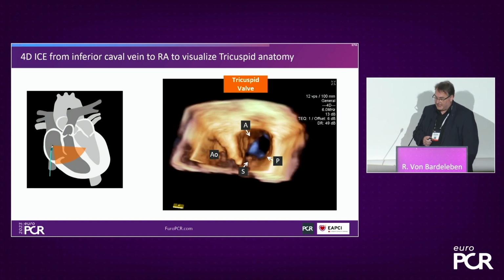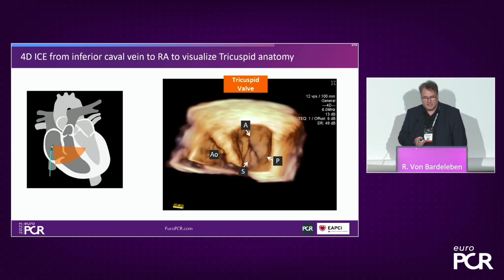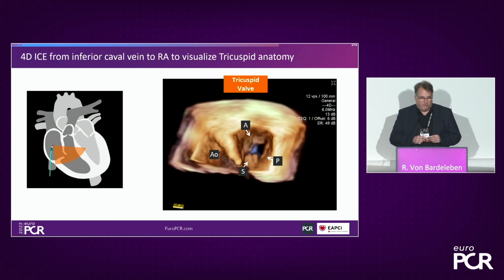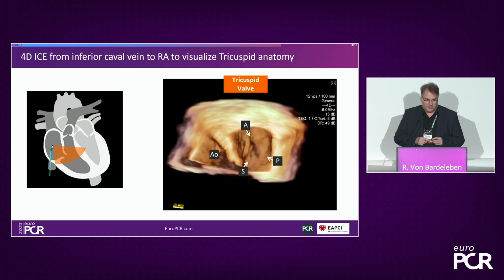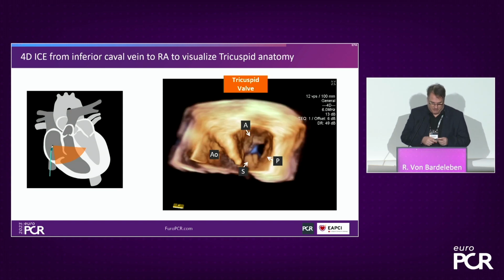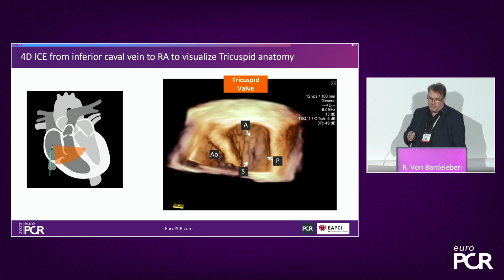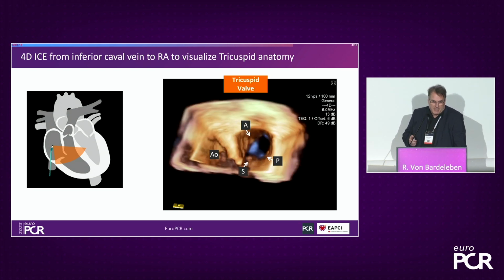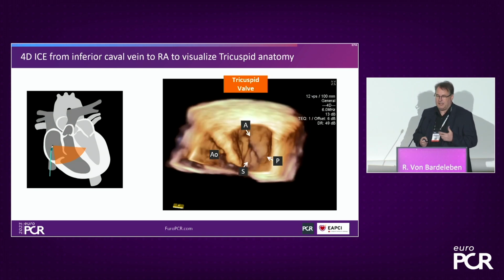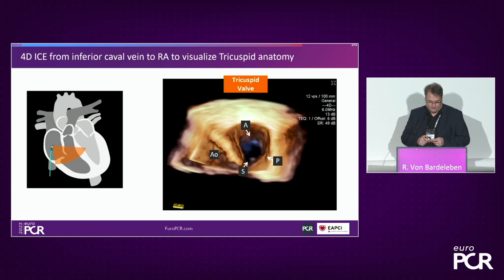So we've seen this slide already, and I just want to use it to help everybody who is not familiar with the ICE situation, but also to make one important point. Unlike two-dimensional ICE, four-dimensional ICE has a much shorter learning curve, because you keep landmarks in your image. So with MPR, multiplanar reconstruction that you may use in CT images, you're able to do this live over minutes, half an hour, 1.5 hours, to depict your interventional scene and to make a lot of different views possible.